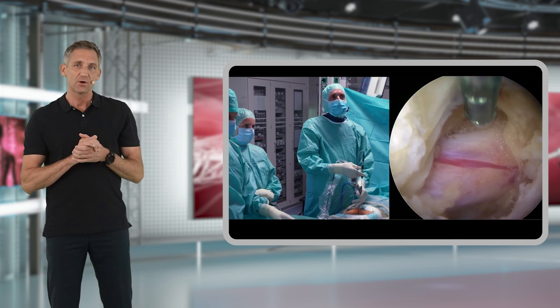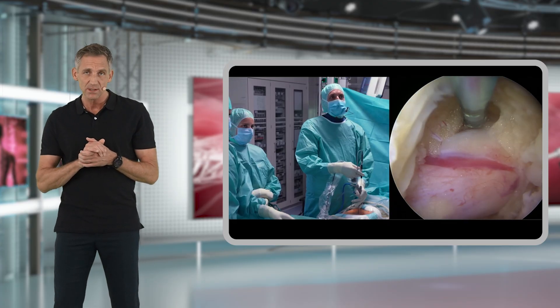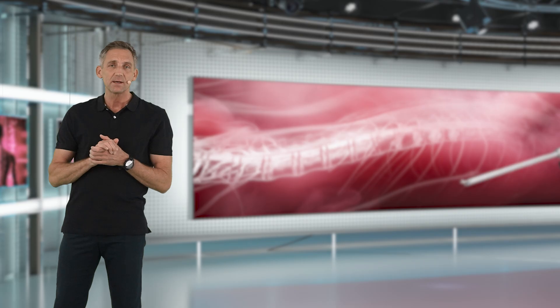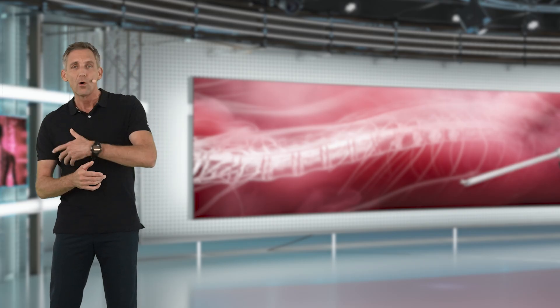This is part of our very focused MIS target surgery. It's not just a smaller skin incision — we also want to make small incisions into the yellow ligament.